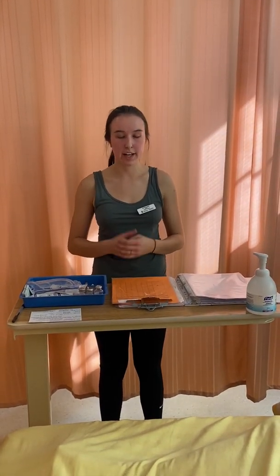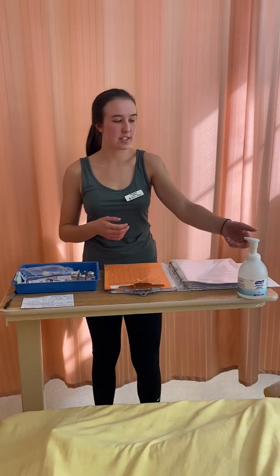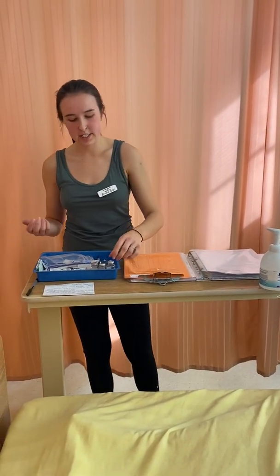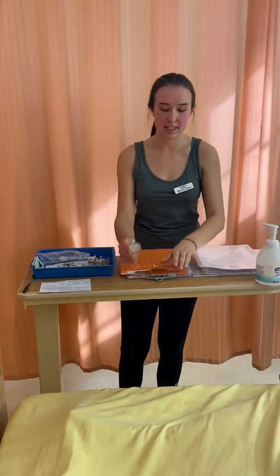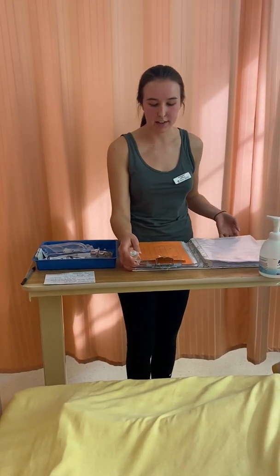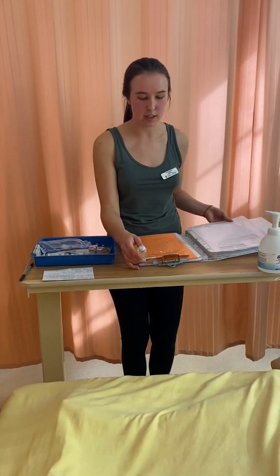Hi, my name is Marissa, and today I'm going to be demonstrating how to reconstitute a medication and administer it via a mini bag. So first, I'm just going to start by washing my hands. I should state that I have already pulled my medication from the Pixis machine, and I've confirmed the identity of my patient using the Pixis.